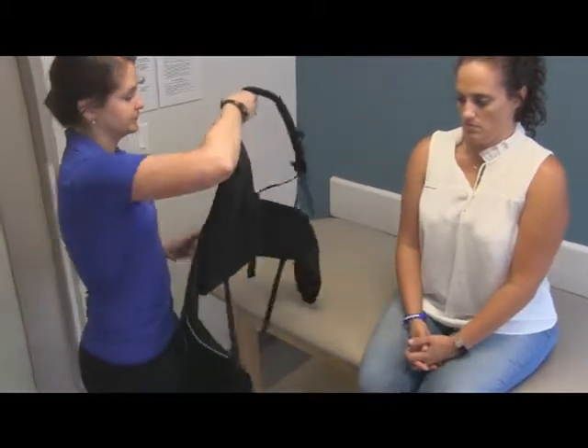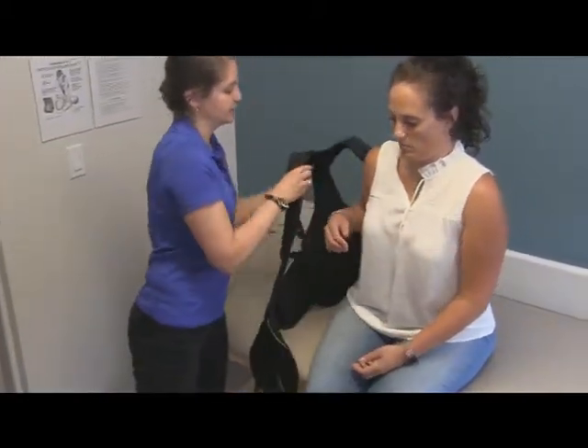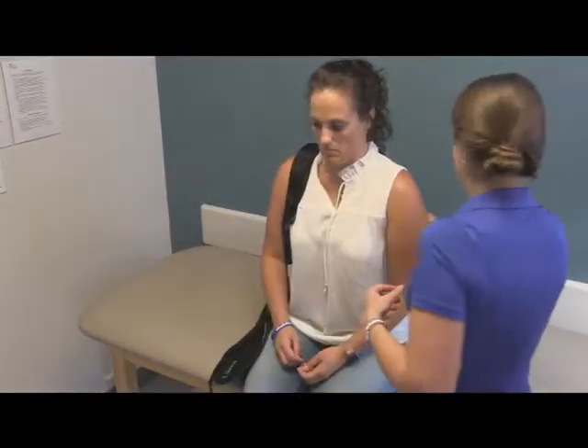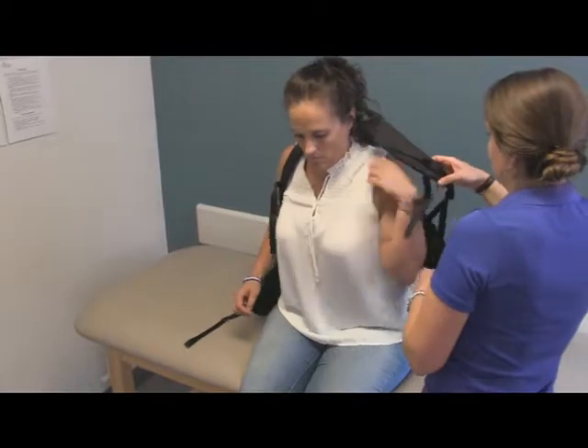To put it on the patient, we're going to get it around behind her and move one arm in — just like you're putting on a backpack — then move your other arm underneath.